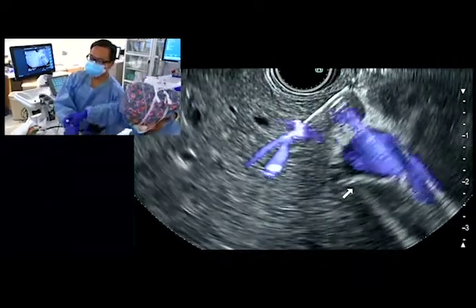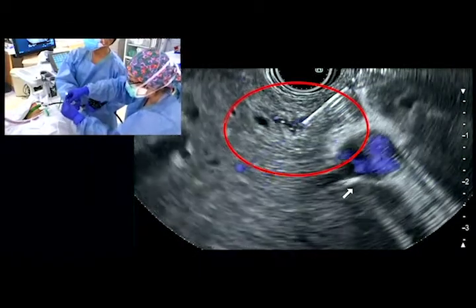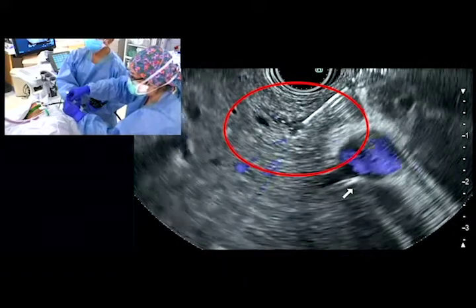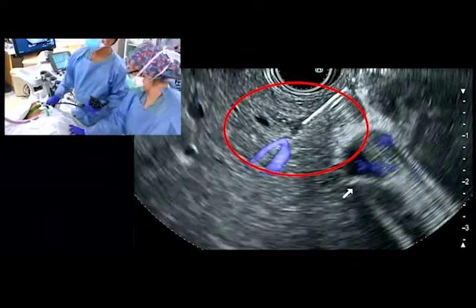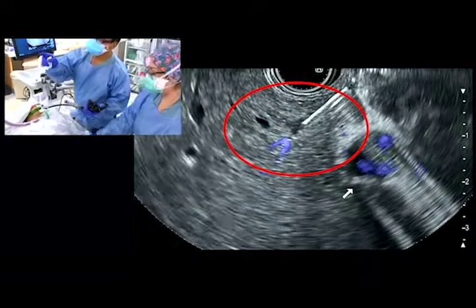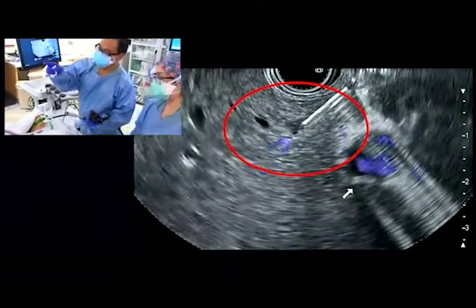As the stylet is inserted into the needle, we can see hypoechoic material enter the biopsy tract, resulting in cessation of flow toward the needle. E-flow confirms cessation of active flow towards our needle, therefore it is safe to remove the needle from the liver.